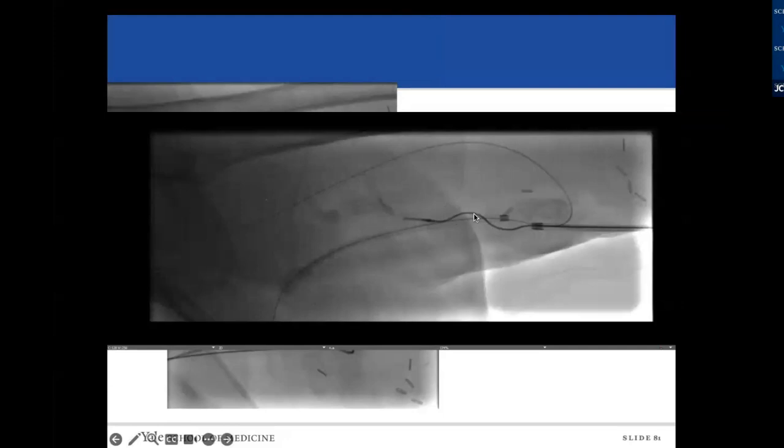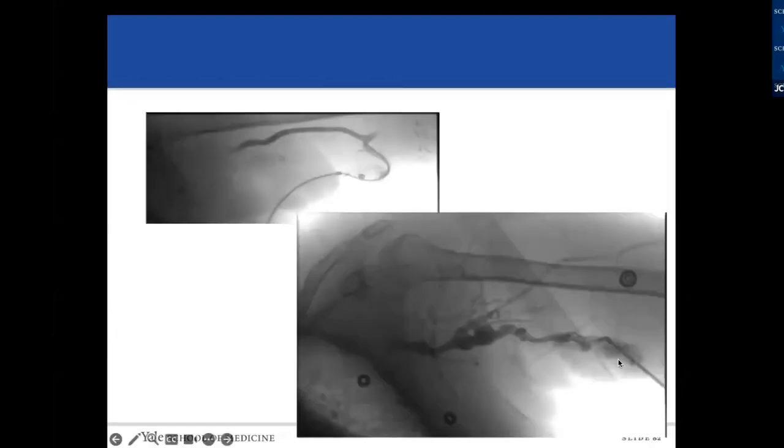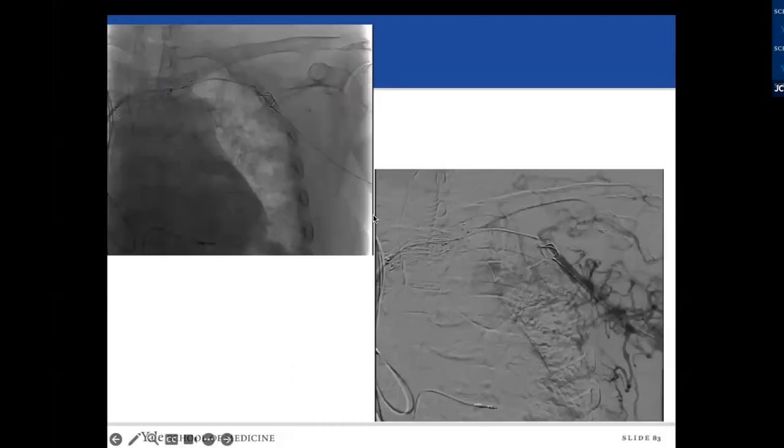So we used the Argon device. It's called the Cleaner, and this turns on itself. You can actually compress it with the ultrasound and get rid of the clot all the way down. Eventually, we got that fistula open, but this usually takes several minutes.